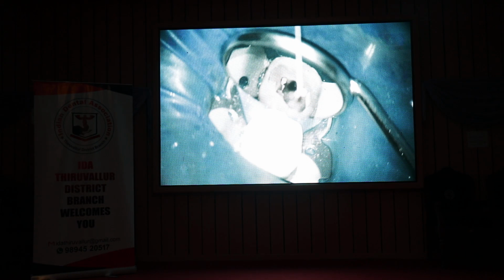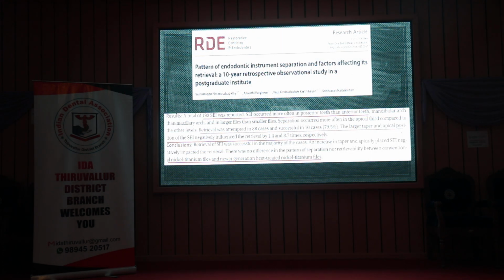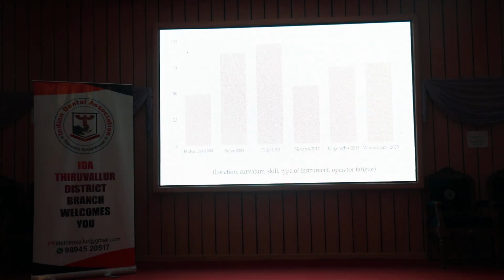Of course, this needs a little bit of specialist work, and this one is going beyond the apex also. So I think maybe you need to get trained before you attempt this, or better refer to a specialist. Okay, and this is one of our own studies. For the past 10 years, we have been doing this, and we also noticed that the success rate for instrument retrieval is 80%. Most often it occurs in the apical 1/3 region, mesiobuccal root canal of the lower or the upper. But if you are careful enough, you will be able to retrieve it 80% of the time.